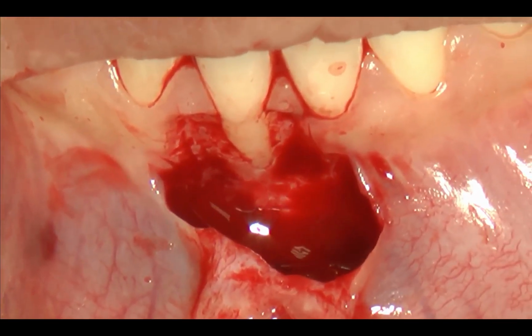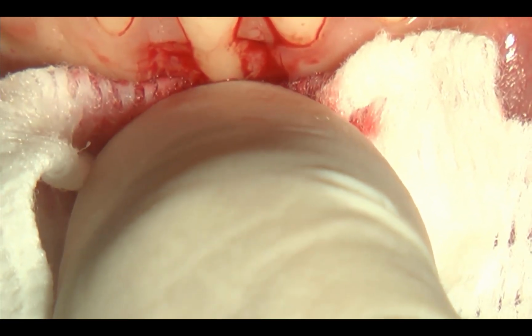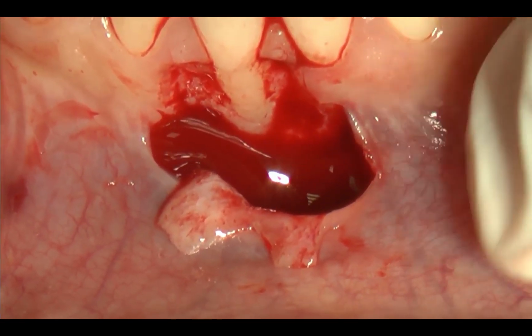Now the removal of the soft tissue has been made. We take a gauze, we start a small compression, and you have to see the verticality of the vestibulum depth that is being completely replaced. Luca, look at this incision line, if she pulls it too much she tears it, it must always be a bit more central. I put vestibular.